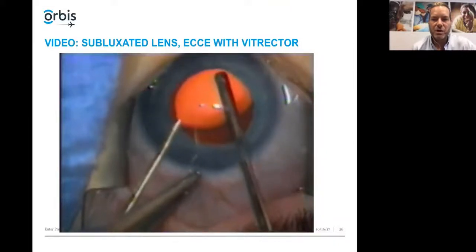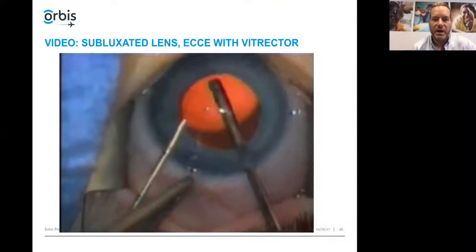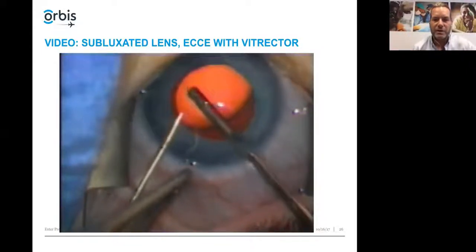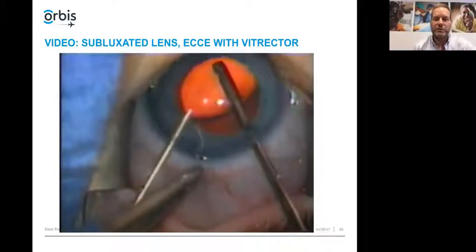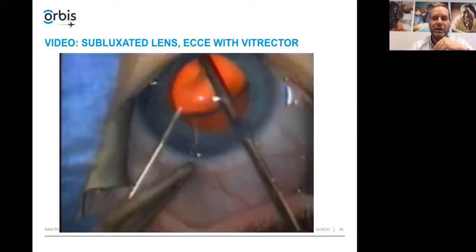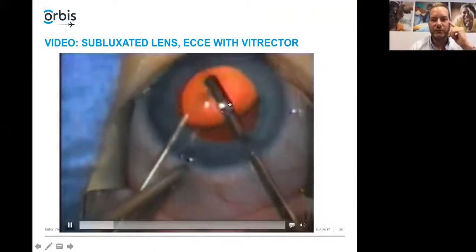Because you just have a small opening, don't hydrodissect. If you throw in a bunch of fluid, it's just going to tear out that small opening. You're going to have a massive amount of fluid that's trapped and doesn't get out of there, so it'll tear out that opening.